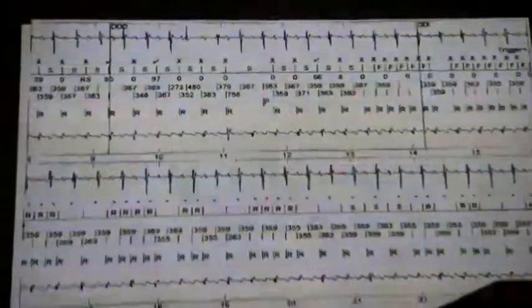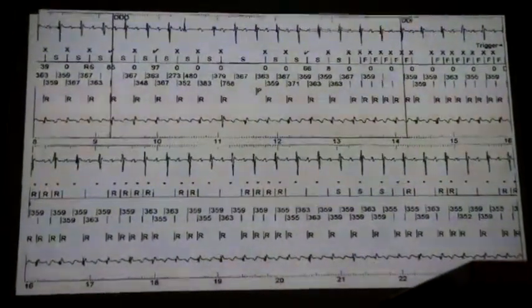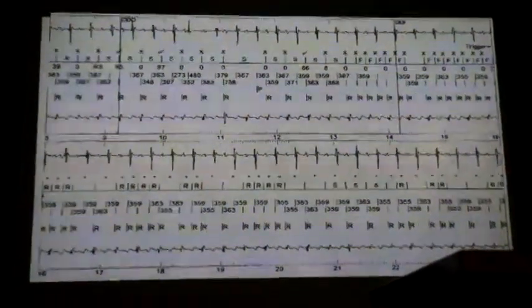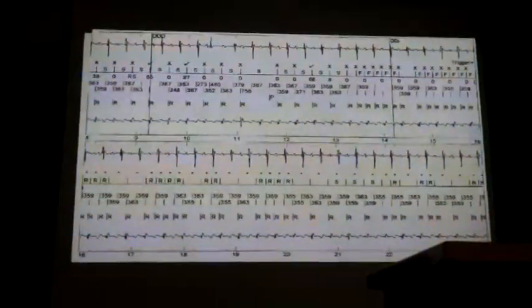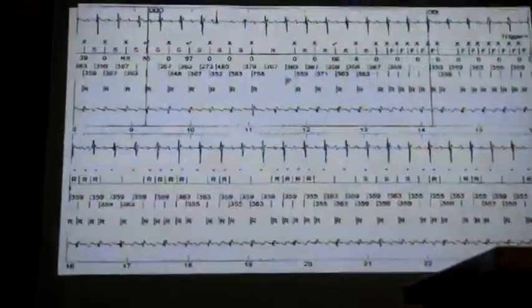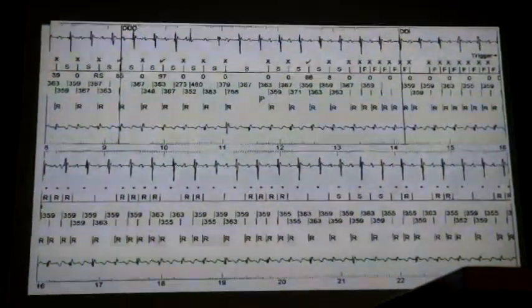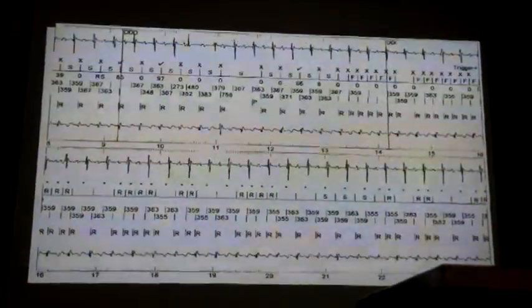So in this patient, with the physician, we elected to dampen his heart rate a bit. Beta blocked him a little bit, just to try and keep his heart rate down, and said, look, just maybe don't go so crazy in the nightclubs on a Saturday night. This is a little Irish fella, right? So anyway, we dampened his heart rate just a little bit, and we haven't seen any problems since. He didn't like the inappropriate shocks, so he's quite good with taking his meds.